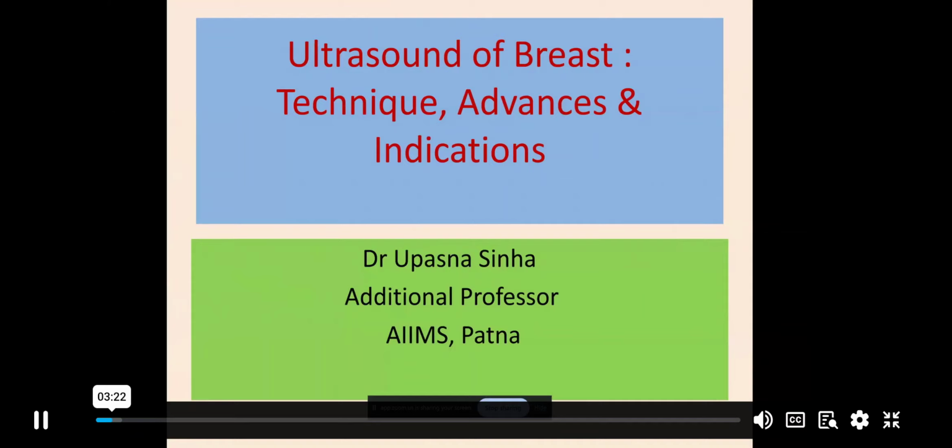Ultrasound breast is not similar to ultrasound abdomen and the like, because breast ultrasound needs lots of optimization of the imaging and lots of adjustment while scanning so that you don't misinterpret the lesions. So, a brief introduction.